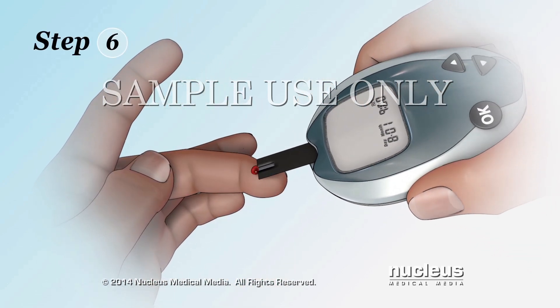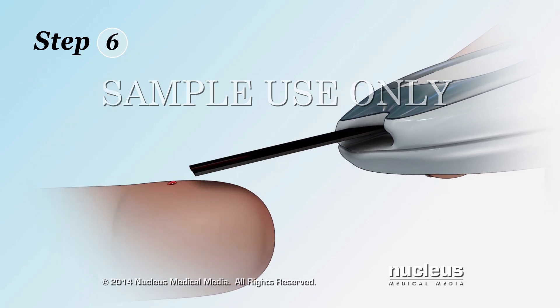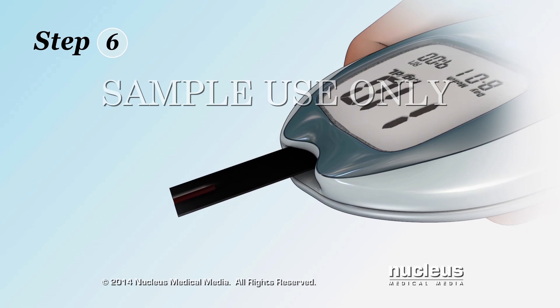Step 6. Touch the correct part of the test strip to the drop of blood but not your skin. The meter will display your blood sugar level on a screen.